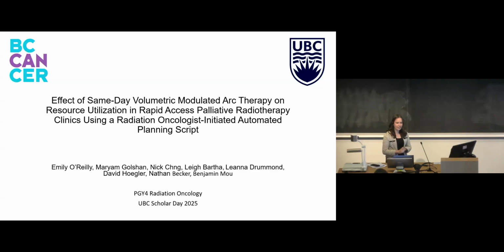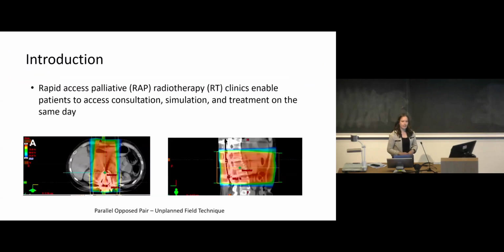I'm a fourth year radiation oncology resident, and today I'm excited to be presenting our project looking at the effect of same-day VMAT on resource utilization in palliative radiotherapy clinics using a radiation oncologist-initiated automated planning script. To begin with a bit of background information, rapid access palliative radiotherapy clinics enable patients to access consultation, simulation, and treatment on the same day.